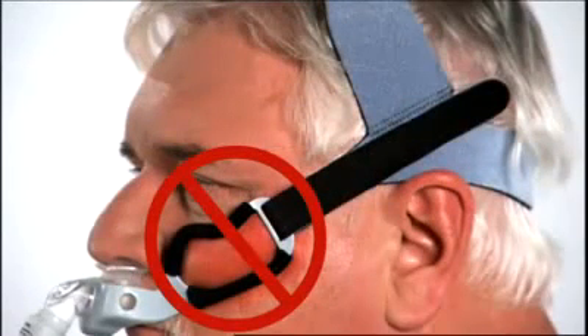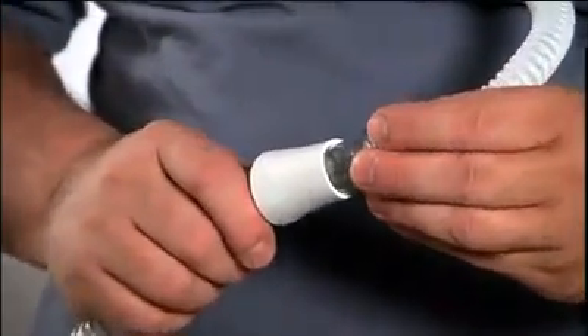Do not over-tighten the headgear. Make final adjustments while lying down. Connect the mask to the device tubing.